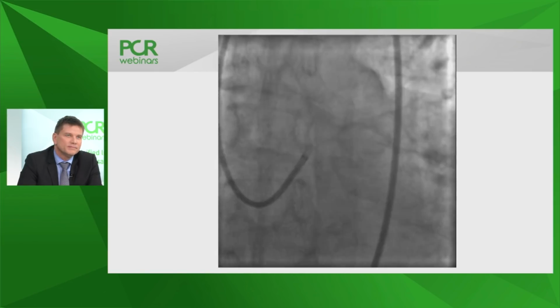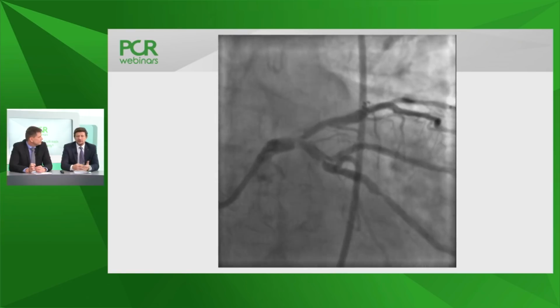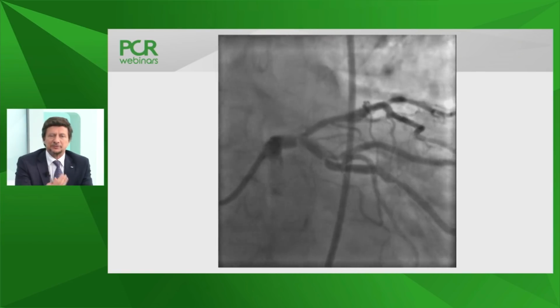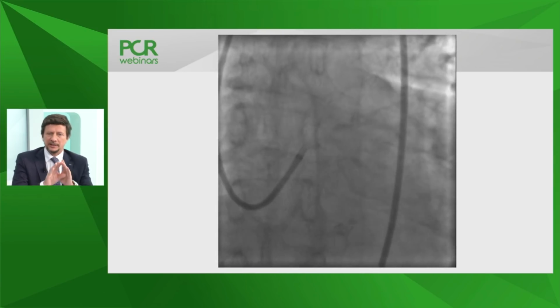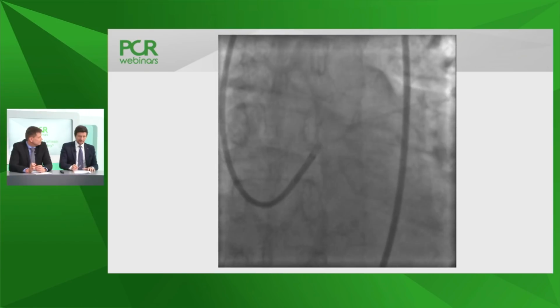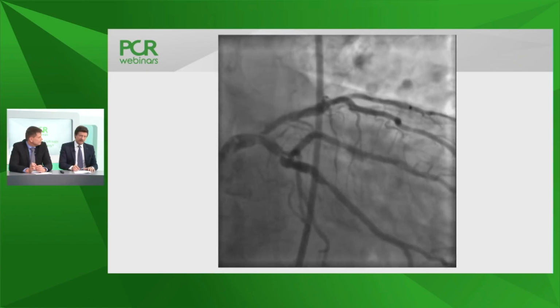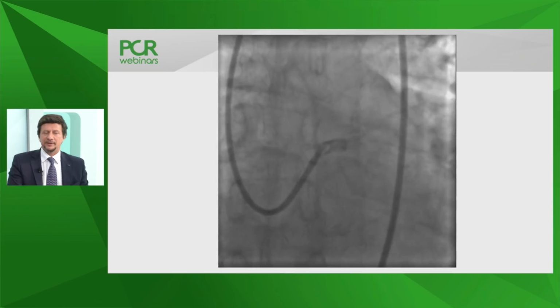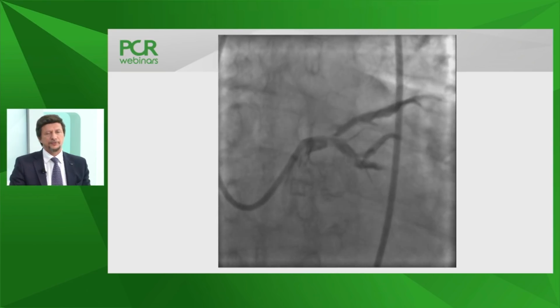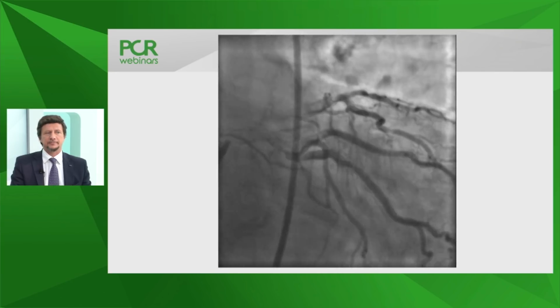Flavio, how about you? Well, my point is not if the balloon will cross, but if the stent will cross, and if the stent will expand. So in the planning, we have to think about the final result we aim to get. And so I wouldn't go with the balloon if I have the needed technology. In a case like this, I would start from the beginning with rotational atherectomy. I see that the colleagues are already warming up.